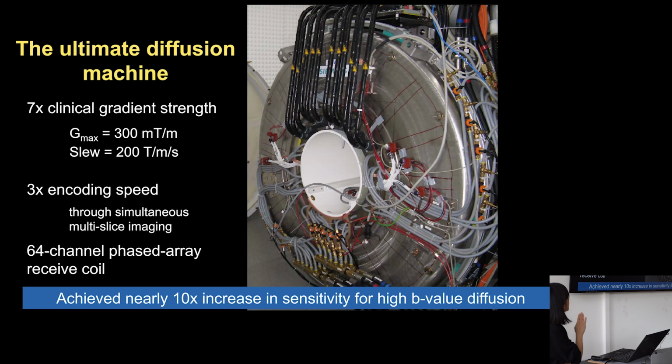So alongside the centerpiece technology, we also developed a slew of advanced acquisition technologies to get the most sensitivity out of whole brain diffusion MRI and to do it in clinically feasible time. Through the development of simultaneous multi-slice with Kawin Setsompop and Larry Wald in our group, we were able to get whole brain coverage in much more efficient scan times.